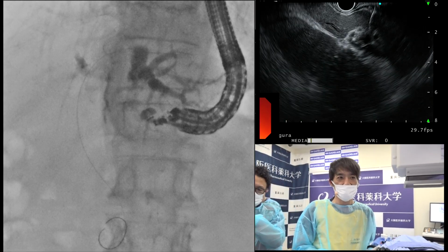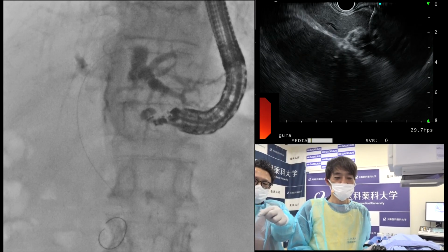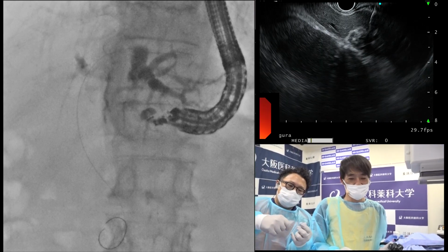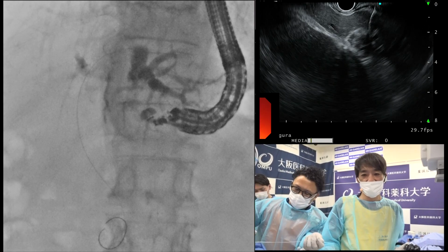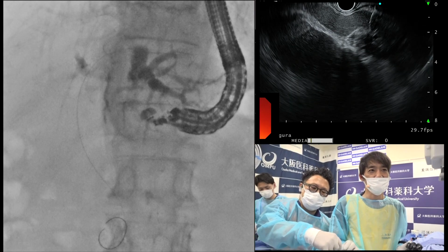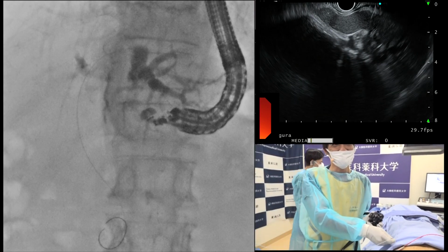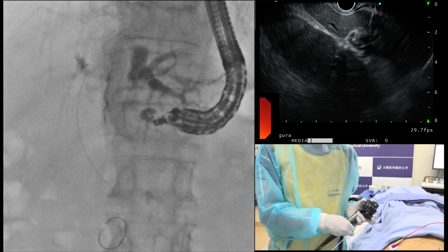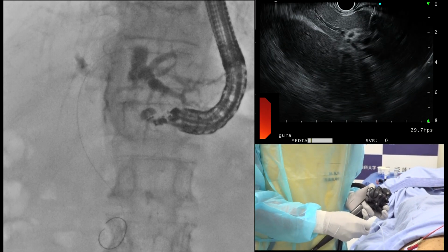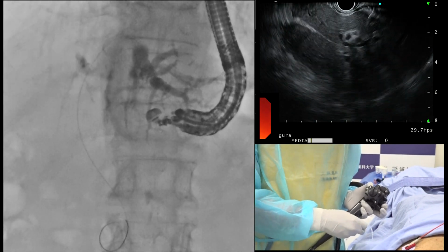Hello, Takeshi. Hi, good morning, Alberto. So in this patient, why do you do two approaches? You do antegrade and hepaticogastrostomy instead of doing one? Yes, because he's relatively young. Also, he will undergo FOLFIRINOX. Therefore, to prevent biliary obstruction and obtain longer stent patency, I chose antegrade stenting combined with hepaticogastrostomy. Okay, fluoroscopy. Next we insert the catheter.